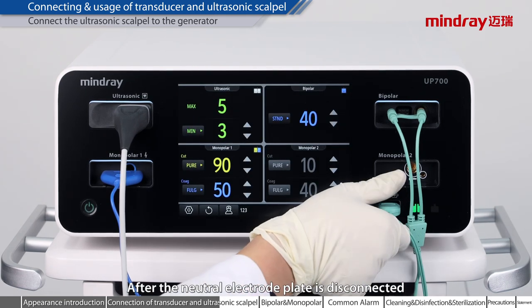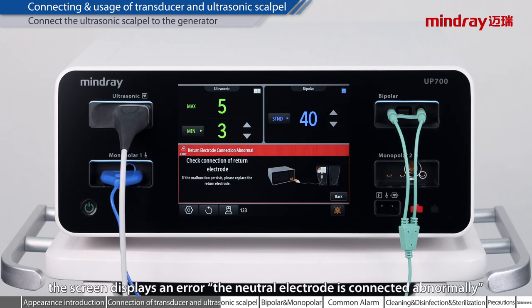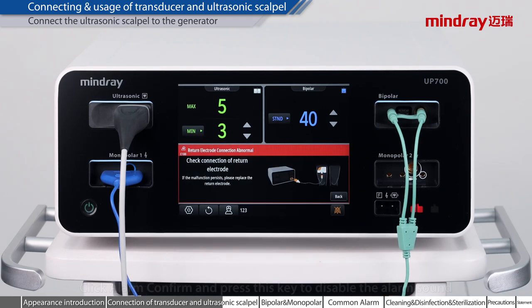After the neutral electrode plate is disconnected, the screen displays an error: the neutral electrode is connected abnormally. Click ALARM CONFIRM and press this key to disable the alarm sound. This icon is grayed out.